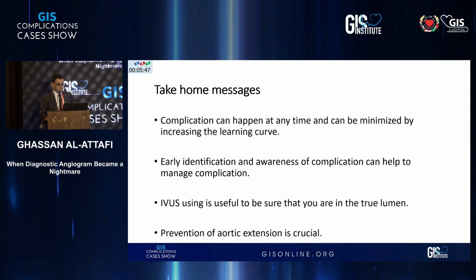Most of these complications come either from the guide catheter, direct injury, or injection of vigorous contrast while the catheter is deeply engaged in the coronary artery, or progressive and excessive manipulation of the catheter, as well as the hard guide wire or inflation of balloon. Here, in a diagnostic procedure, most likely the complication comes from either a non-coaxial catheter with the origin of the coronary artery or vigorous injection. The most important message is that if you recognize dissection, do not inject further, because this will expand the dissection.